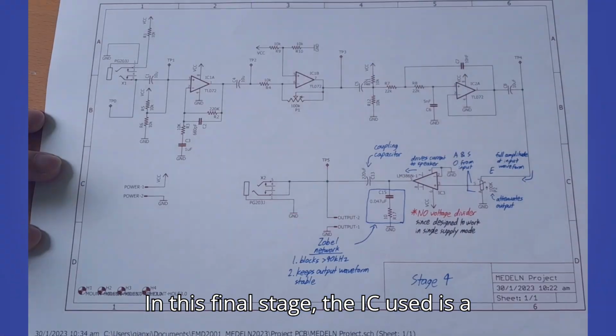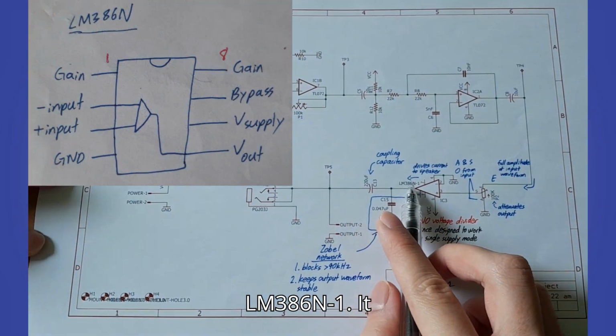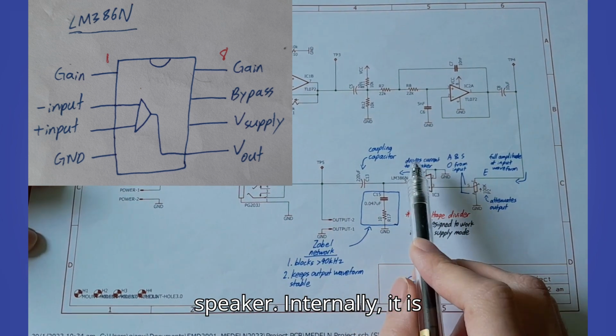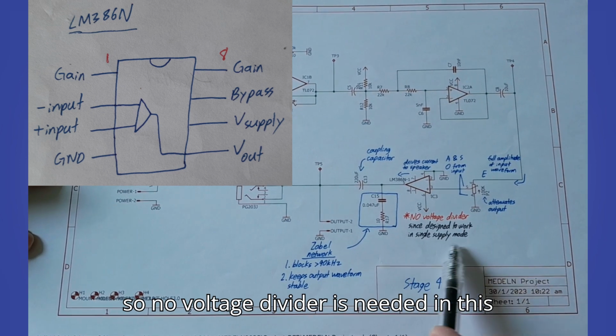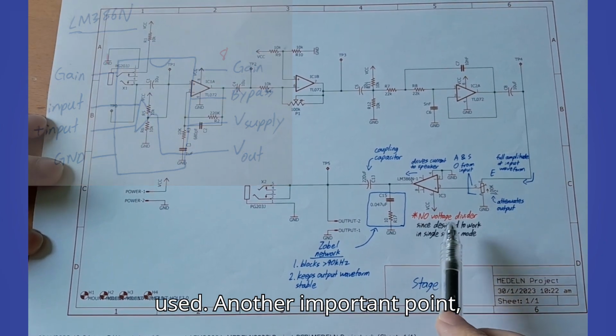In this final stage, the IC used is a LM386N-1. It is an audio power amplifier that drives a speaker. Internally, it is designed to work in single supply mode, so no voltage divider is needed in this stage, unlike the rest of the amplifiers used.